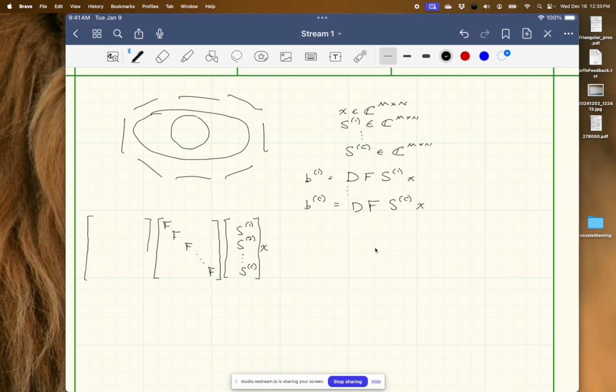And then each coil collects the same data at the same frequencies in the Fourier domain. So we make a giant diagonal matrix D like so. And this is going to equal the column vector B1, B2, etc.